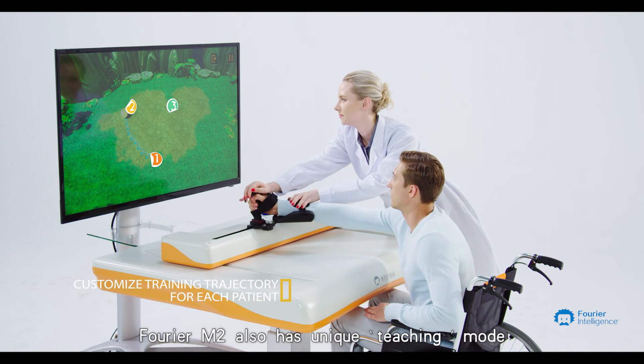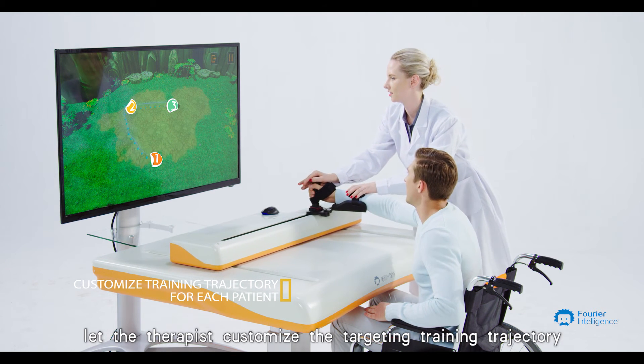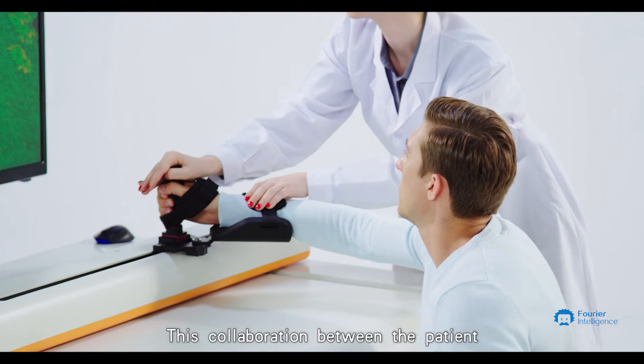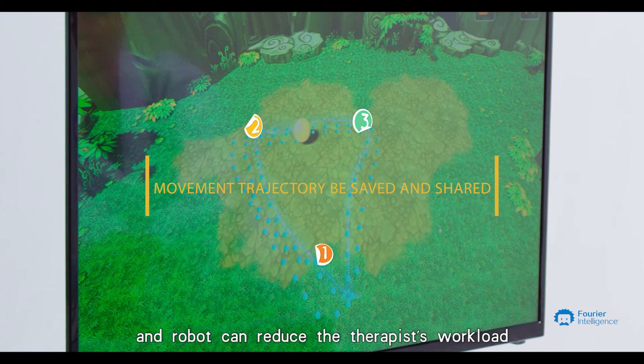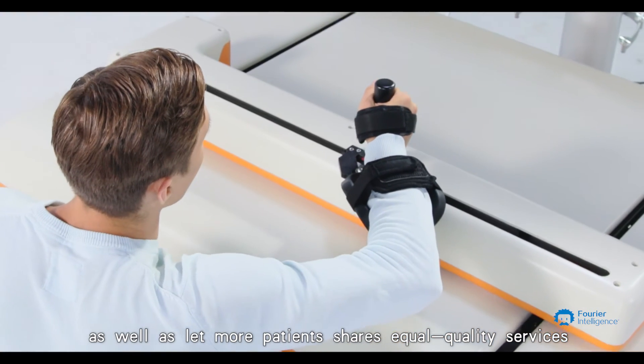Furrier M2 also has a unique teaching mode that lets the therapist customize the target training trajectory and schedule for different patients. This collaboration between the patient and robot can reduce the therapist's workload while allowing more patients to share equal quality services.